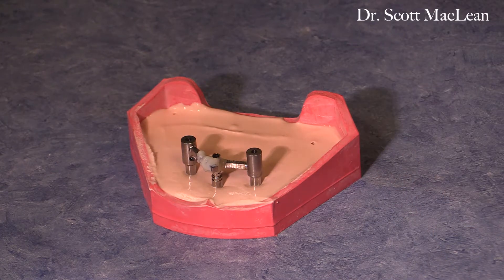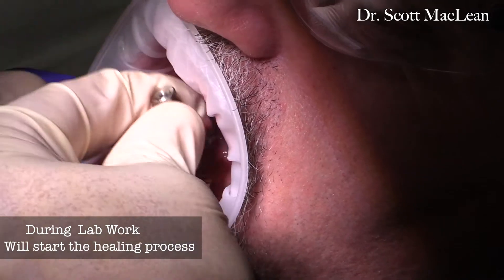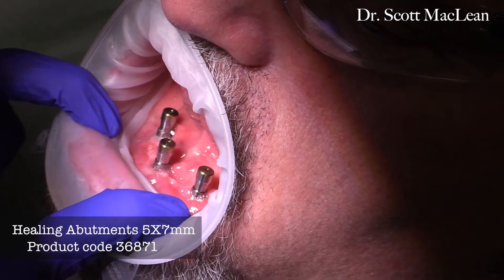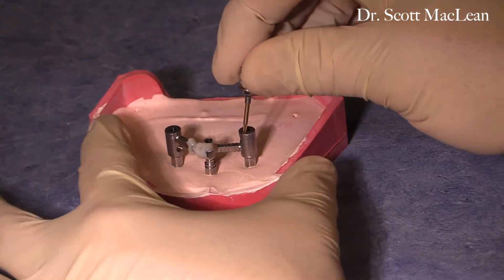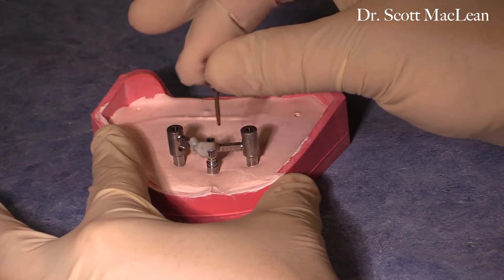By doing this we'll make a MasterCast that we're going to verify and use to fabricate the lower implant bridge. At this point the patient's going to have a bit of a break, so you may want to put on the healing abutments, which are five-by-seven bridge healing abutments. These are put into place, allowing the sutures to settle and giving the patient a little bit of relaxation.